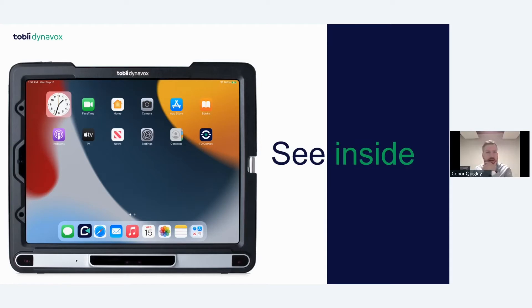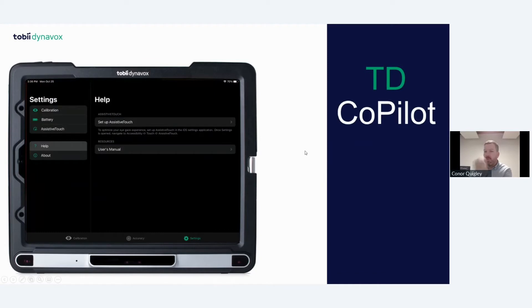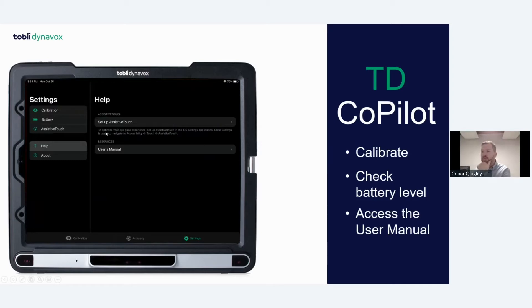Drop any questions into the Q&A. Looking at the software: the first app is the CoPilot, which comes on your device when you get it. This is how you set up your eye gaze — doing calibration, checking battery level, accessing your user menu. There are assistive touch options where you can change the responsiveness of the eye tracker and the tolerance — how quickly or slowly the eye tracking responds — depending on the user.